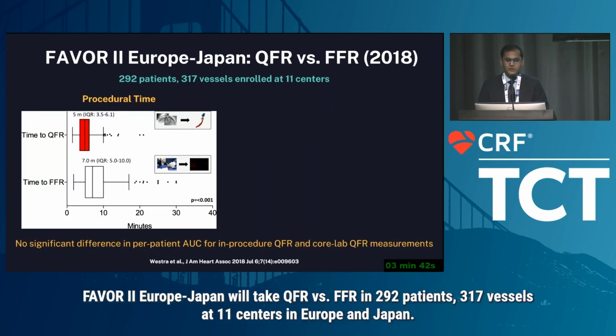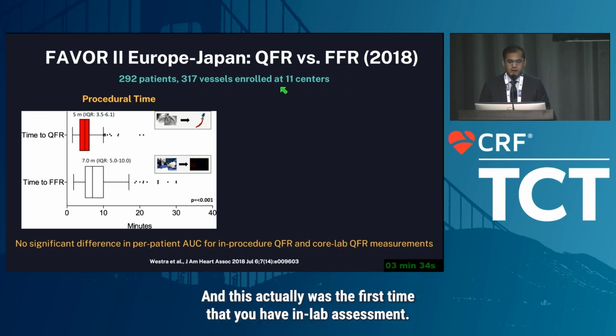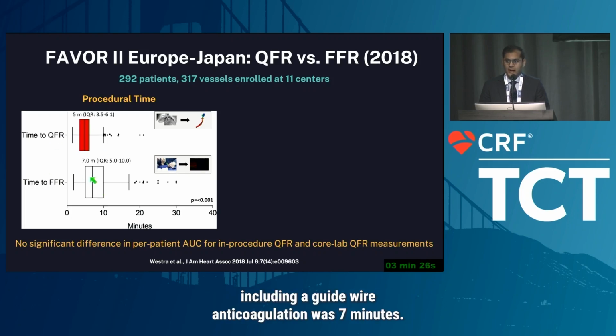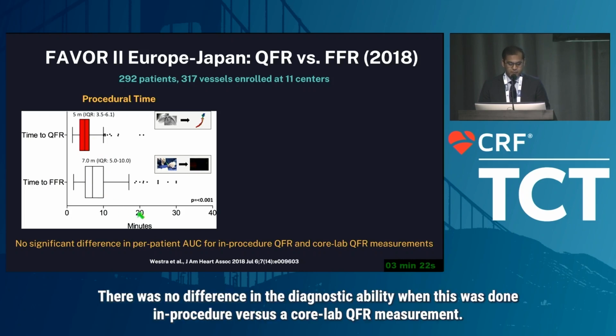FAVOR 2 Europe Japan looked at QFR versus FFR in 292 patients, 317 vessels, at 11 centers in Europe and Japan. This was the first time you had in-lab assessment. The time to QFR was 5 minutes versus 7 minutes for FFR, including a guide, a wire, and anticoagulation. There was no difference in diagnostic ability when this was done intra-procedure versus a core lab QFR measurement.